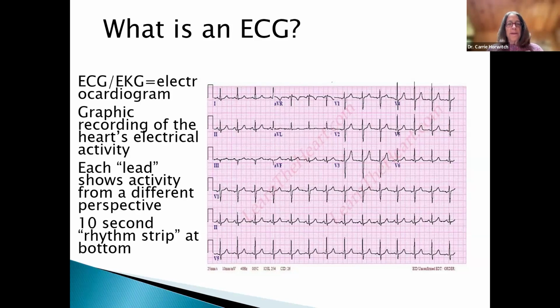Some of the EKG machines will only give you one option for rhythm. Others, like this one, will give you 3. It usually is lead 2, and then you might also get another lead like a V5 or V6. Next slide.